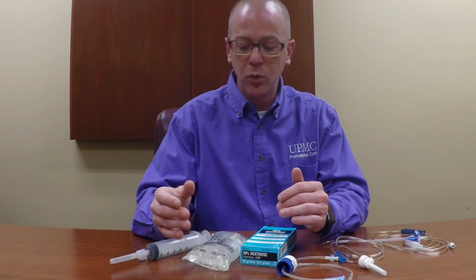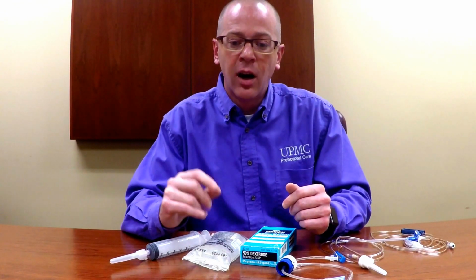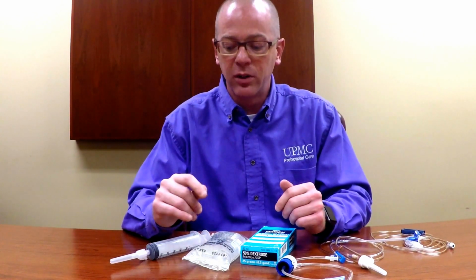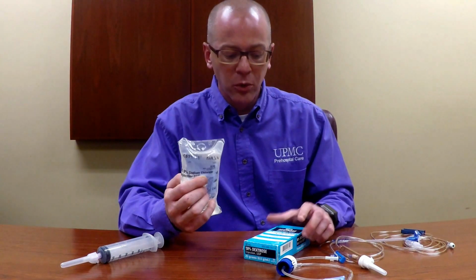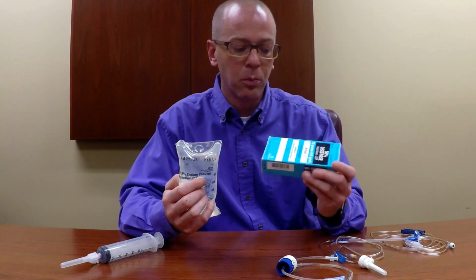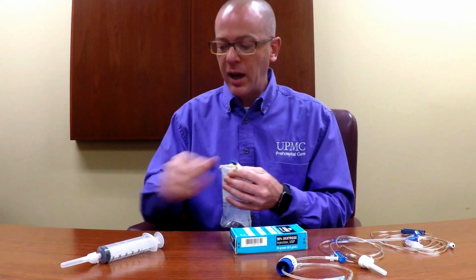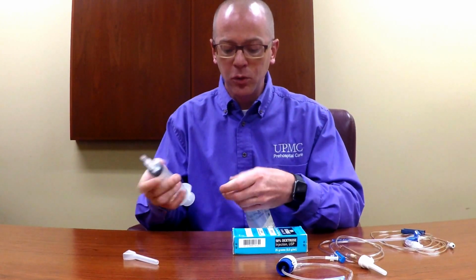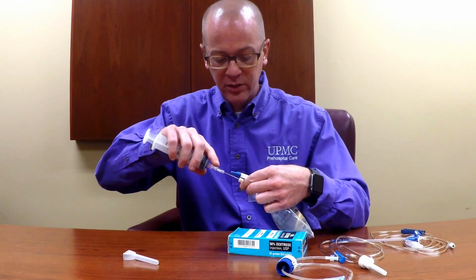So assuming I have a 20 kilogram patient, I would administer 40 cc's of this volume. Next, we have to be able to create the D10 solution from the equipment we have in the truck, and then use the dosing chart provided and consult with medical command to arrive at and verify that we're administering the right dose. So I start with my 250 bag of normal saline solution and my traditional pre-filled amp of D50. For my 250 bag, I get a 60 cc syringe and a needle, and I'm going to remove 50 cc's of volume from this bag, leaving 200 cc's of fluid.